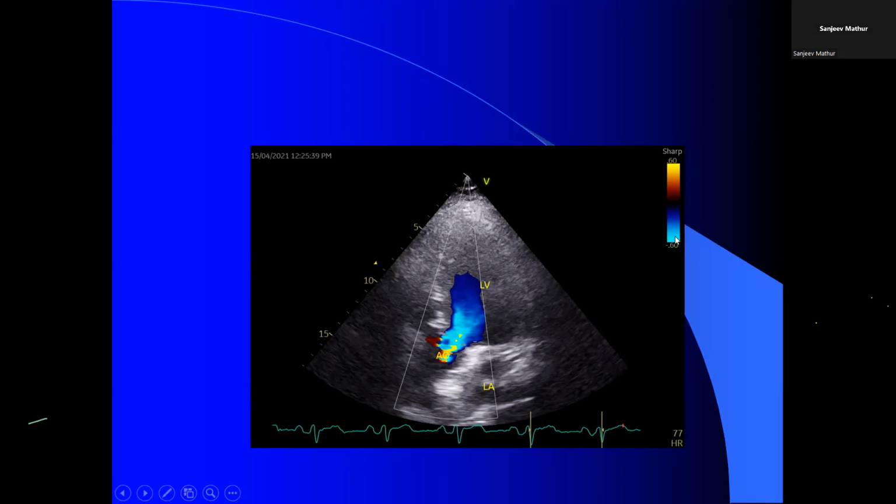Now, for example, in certain valvular regurgitation, we keep it at about 0.54 or so. If you find that it's a very disturbing flow which you cannot see, then you can slightly increase the velocity scale here. The Nyquist limit here you can see both above and below the baseline. Below is blue, above is red or so. So these adjustments can be made depending upon the case-based method also.